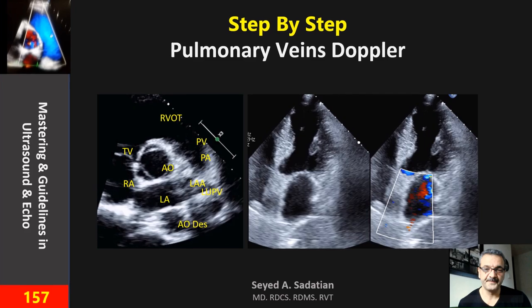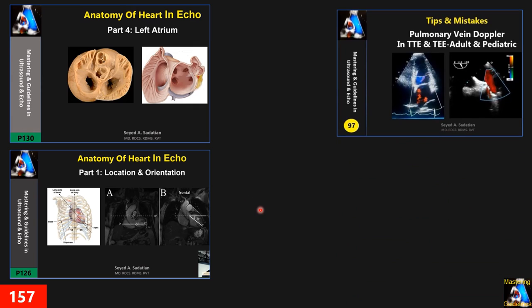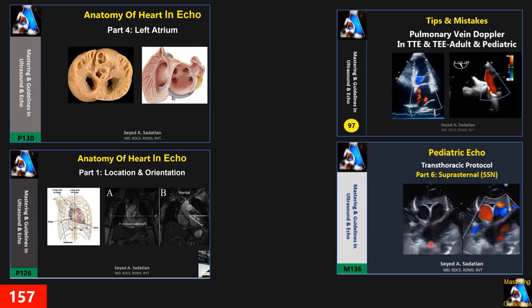Hi everyone. Today we cover how to perform pulse Doppler for the pulmonary vein in adults through transthoracic echo. For more information, I recommend checking the clip on Anatomy of the Heart in Echo — part on left atrium, location and orientation — as it helps a lot with spatial imagination when scanning. For pulse Doppler of the pulmonary vein in pediatric and in TEE, check those dedicated clips.